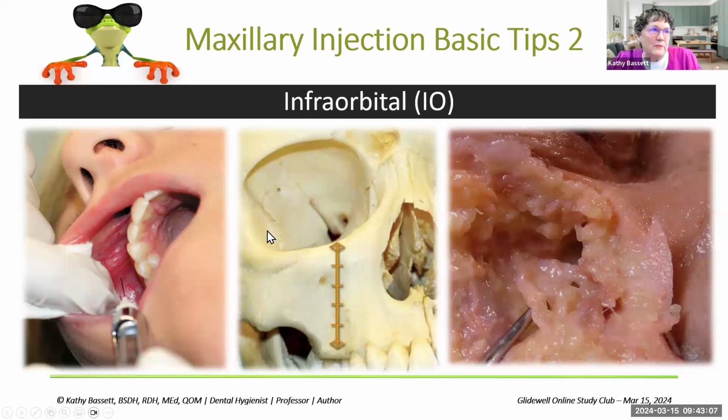There's really dense bone protecting the high value assets of the eyeball. So if we're depositing our solution here underneath the foramen, near the foramen, and again, we aren't challenging that bone, the eye is protected. We're not going to enter into that and actually come in the bottom of the orbit. It just doesn't work that way.